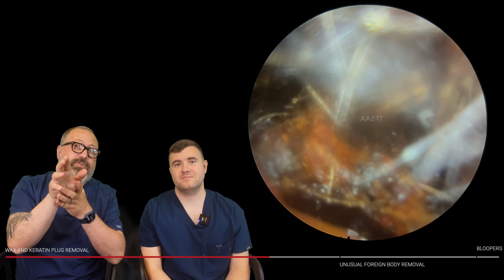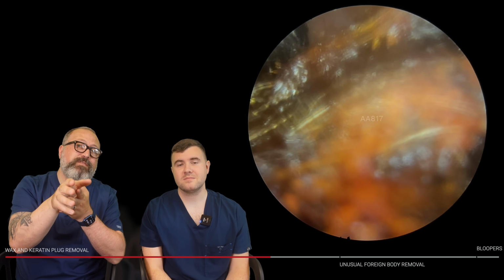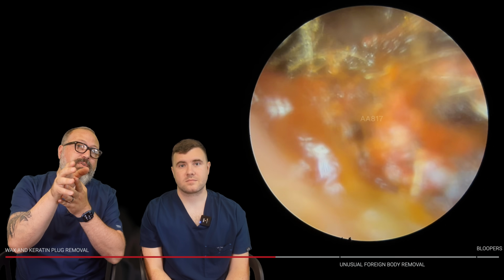So we're going to go in with the St. Bart's hook. If I can get beyond that gap, I've got a chance of scooping this around the corner. So let's see if we can drop nearly. There we are. Now we're behind. Let's see if we can pull this around.